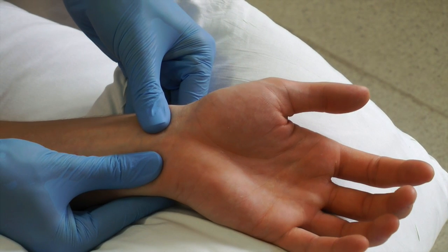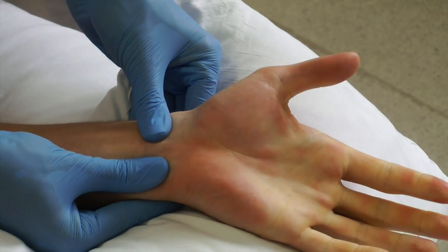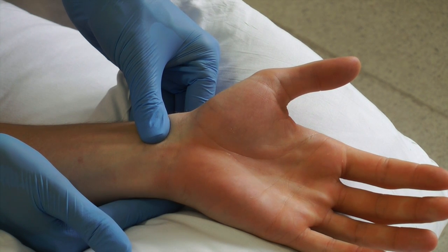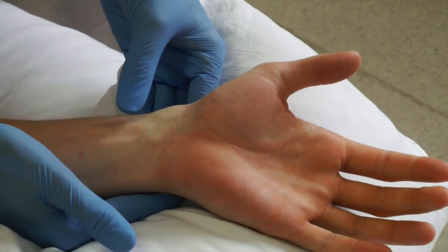Conduct an Allen's test. Occlude both the radial and ulnar artery. Ask the patient to make a fist repeatedly, blanching the skin. Test the patency of the ulnar artery by releasing the thumb. This will show the hand being re-vascularised if the ulnar artery is patent.